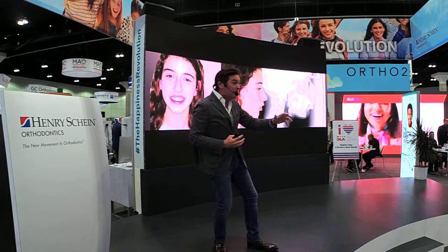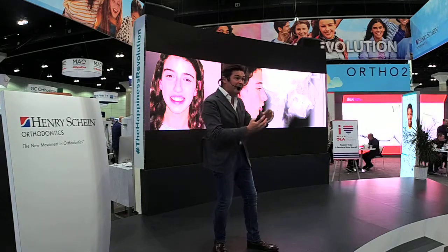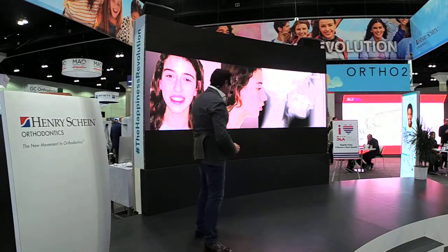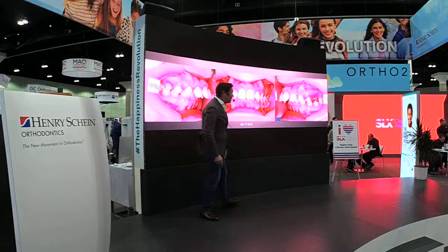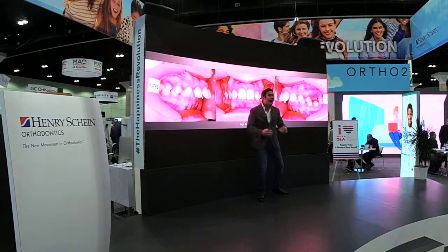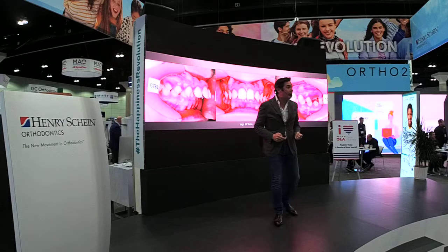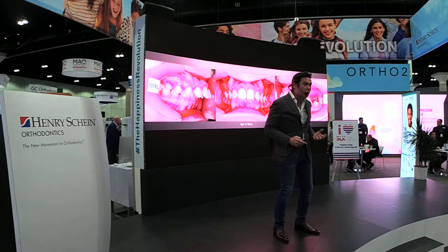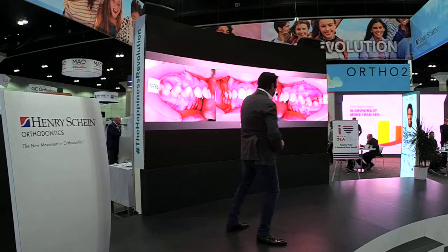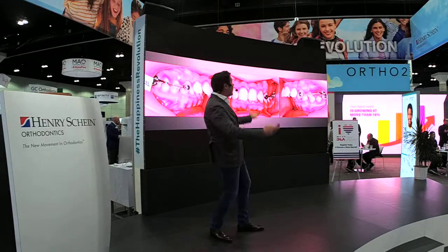Well, if we want to do it dentally, it will be a mess, because we will destroy the profile of the girl. What we need is to invite this mandible to relocate forward. But this is a super class 2, super overjet, super class 2. Can this be handled with aligners? Of course we can, but we have to do it better together. We start with the motion, we place the motion, and we accomplish.